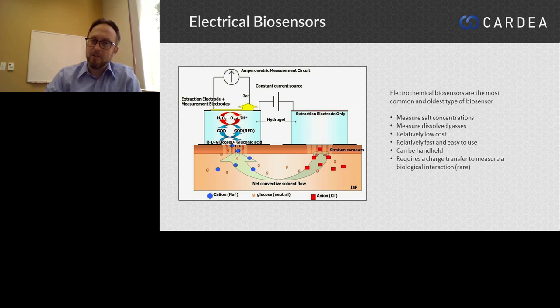And that can work when you're trying to measure oxygen or glucose or salt, but it doesn't work with most biology that's interesting or useful. It also generally requires relatively high concentrations. Now, even with all of those limitations, you can still see very powerful biosensor systems like the iStat, which is a handheld biosensor from Abbott, I believe, that allows you to do a lot of different handheld biosensing measurements. It's not quite exactly what we're talking about for a digital biosensor, though, because you're not getting a lot of complex biological interactions. You're getting a snapshot of some of the more energy transfer related interactions of biology.